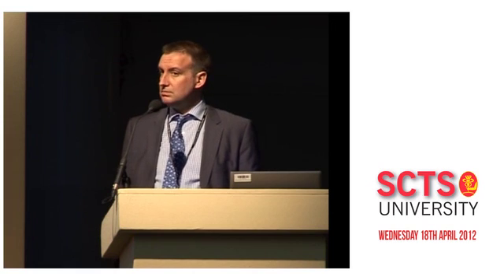One other quick question. If you get a cardiology patient who's been in AF for a week or 2 weeks, they need a TOE. Do you just look at the left atrial appendage and then say, fine, cardiovert? Or do you look at the left atrial appendage and then do a 20-minute, 30-minute examination? Well, certainly if I'm giving the anaesthetic and it's a cardiologist, I don't let them do a 20-minute examination. It's usually the SHO they send, so you can usually bully them.